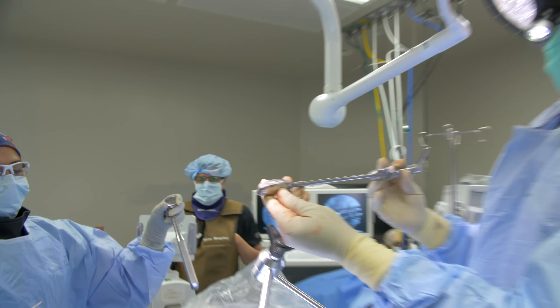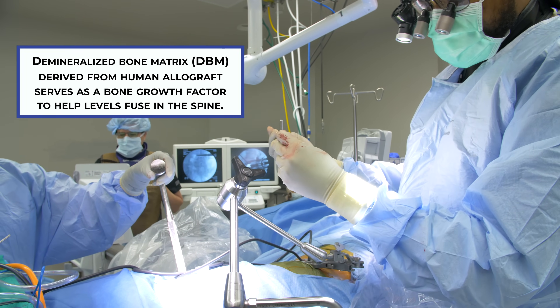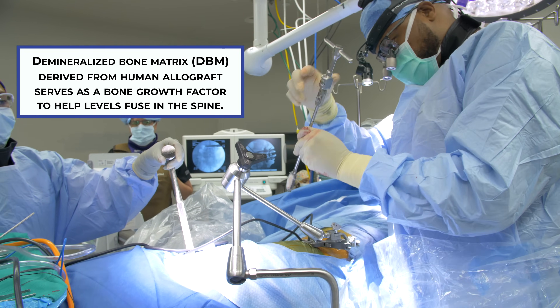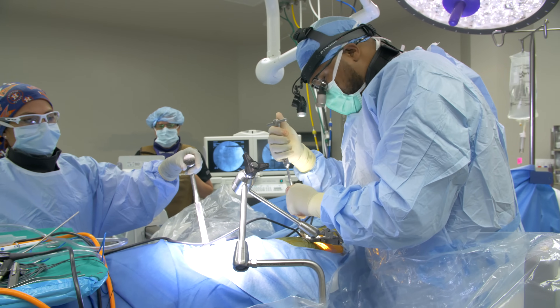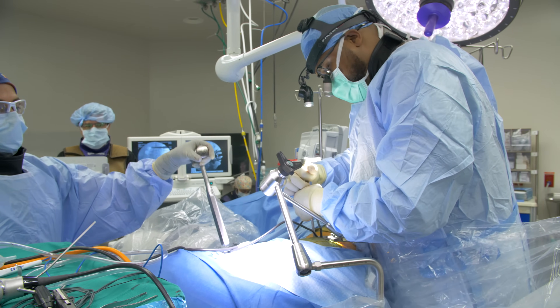This is the cage loaded with bone graft — DBM, demineralized bone matrix. The anterior portion is oriented correctly, and this is going into the void we created.